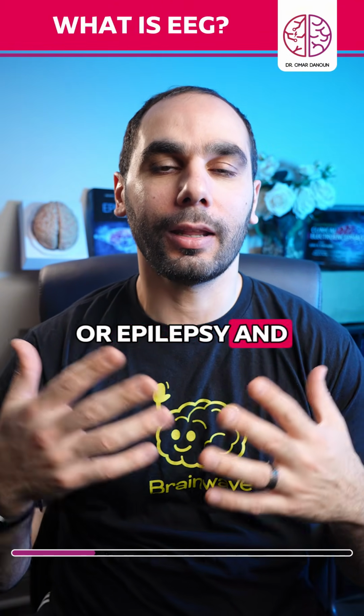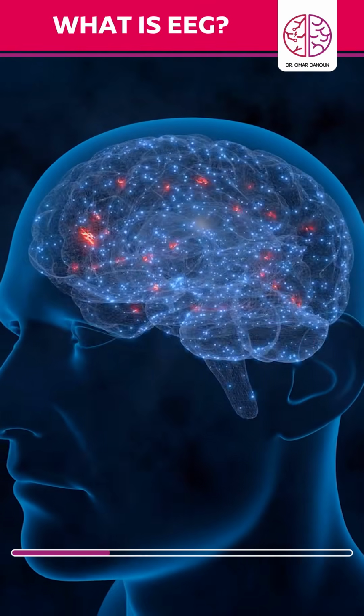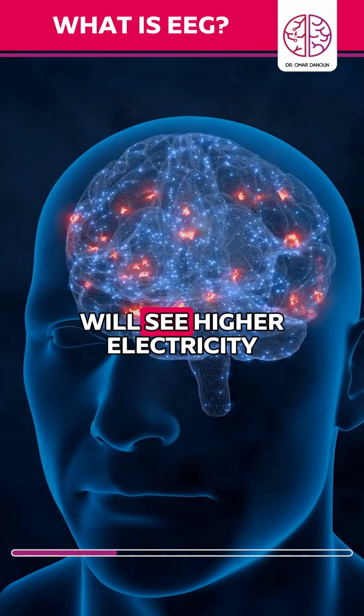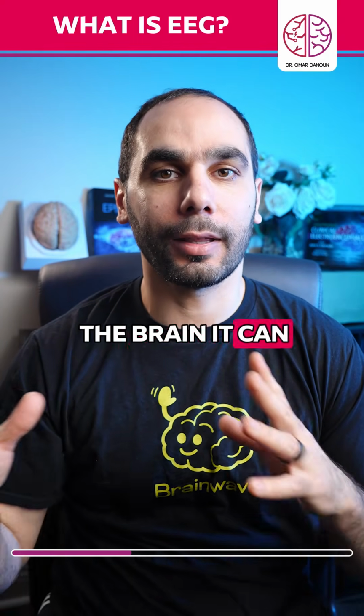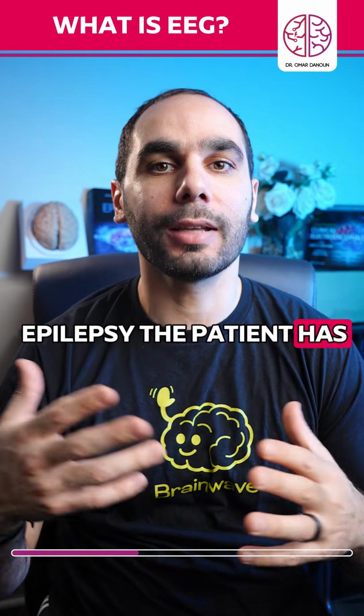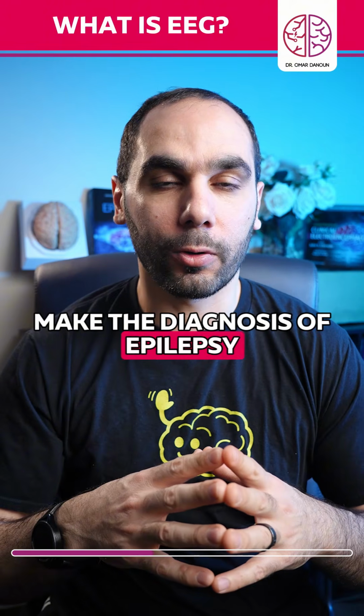or epilepsy. The EEG test is a unique test that tells us the brain's electricity, and in epilepsy we will see higher electricity in some areas of the brain or all over the brain. It can tell us what type of epilepsy the patient has and where it is coming from, and it can help make the diagnosis of epilepsy or confirm it.